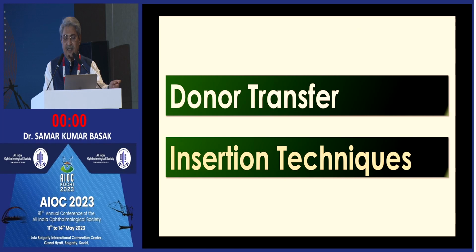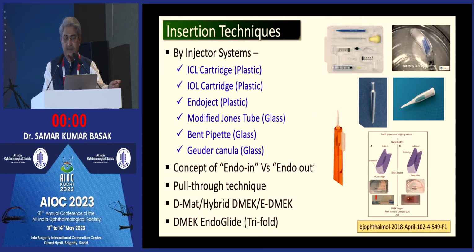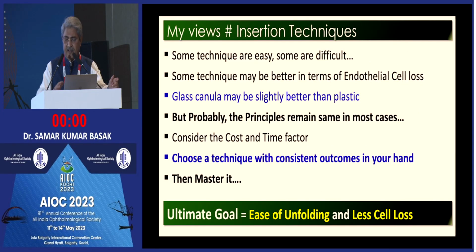So, donor transfer and insertion technique. Again, there are many techniques. Rajesh will share most of them. I am showing some of my same technique but different orientation. Whatever insertion technique you are using, remember that almost all are the same. The main theme is that there should be less manipulation in the anterior chamber, ease of unfolding, and your endothelial cell loss will be less.